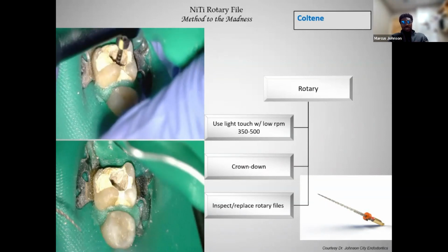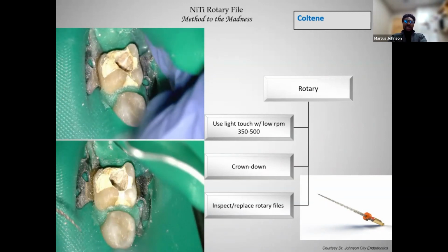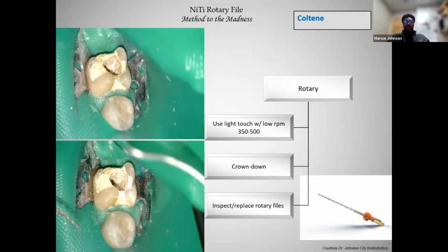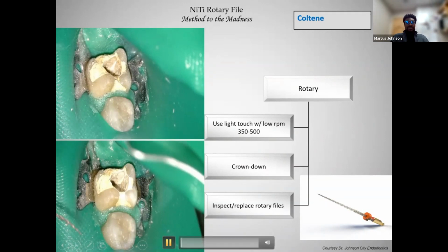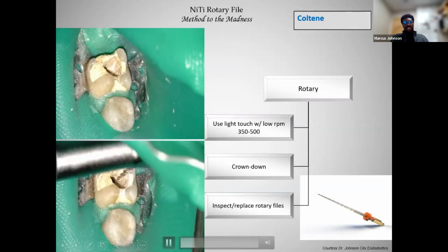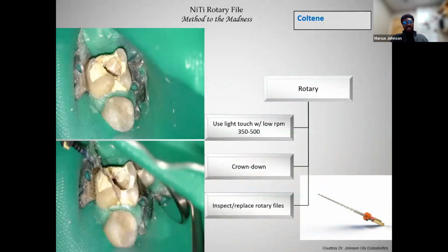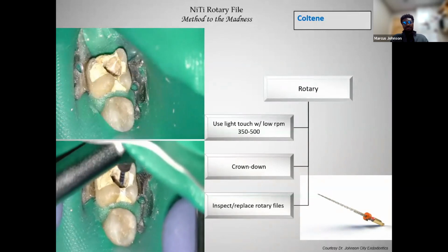And this is a cordless handpiece, which allows me to really function well. The ergonomics is helpful. I'm a rather tall guy, and I use the scope, but I always want to be aware of my posture. And so using these files as well as the cordless handpiece has been a lifesaver. Again, you can see I put a nice bend into the file. Cleaning and shaping, just getting in there right around that curve. See the nice bend, and it holds that curve. And then I'm good to go.